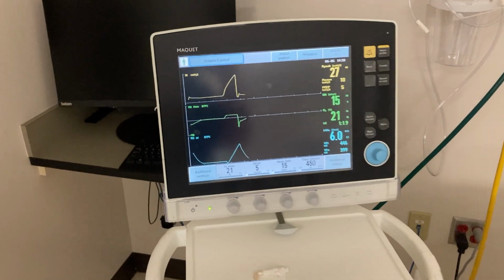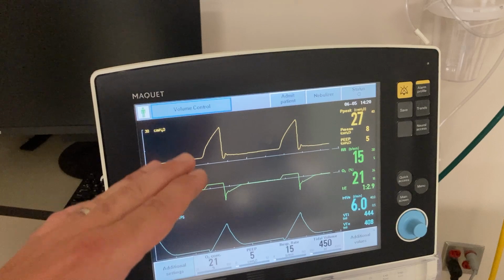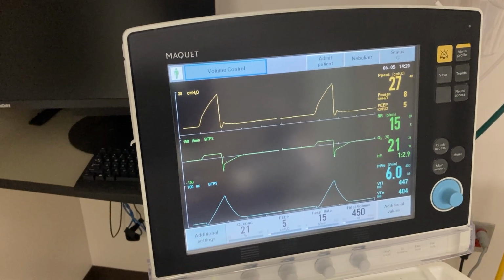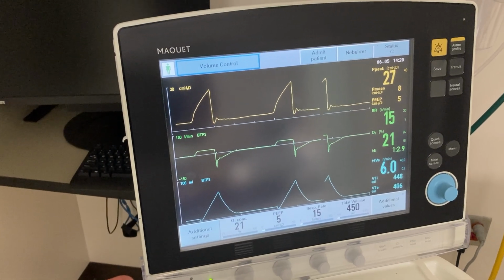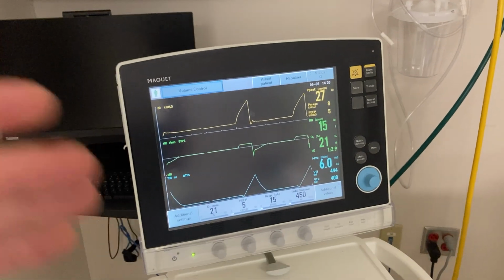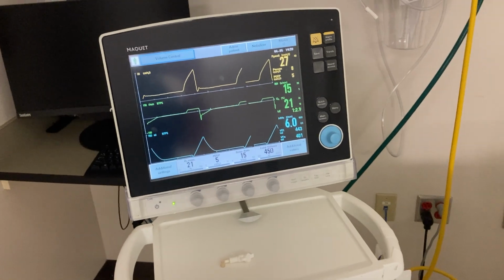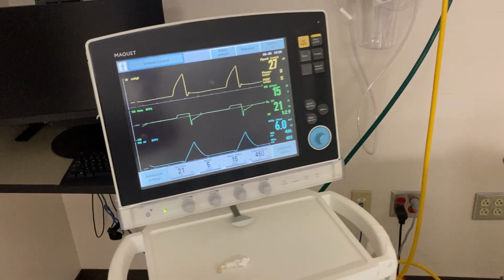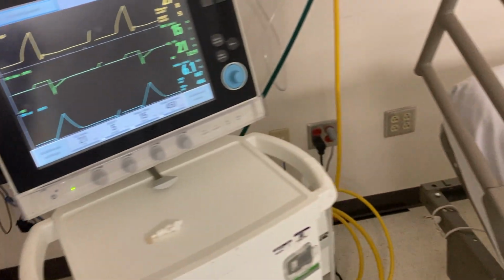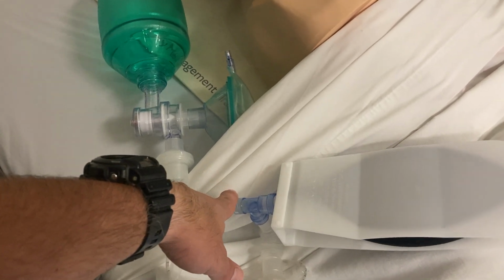And now, one other thing to take a peek at. So I turned the 0.4 second pause off, and we'll notice that our pressure waveform looks much better. So now I've got to try to figure out where the leak is. If you have a ventilator alarm or there's a problem with the alarm and it's not immediately apparent, you should disconnect, manually ventilate, and ensure that the patient's ventilating before you spend X amount of time troubleshooting. In this case, I can absolutely hear already with this suction catheter where the leak is, and I can feel it.